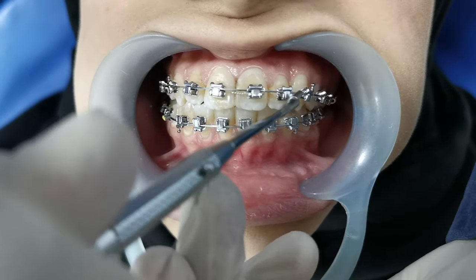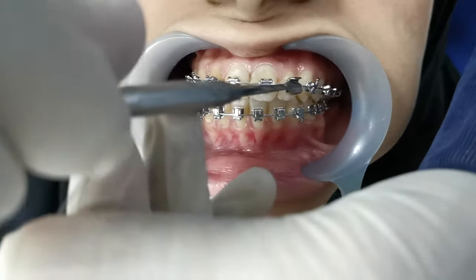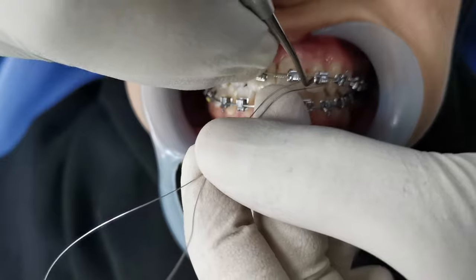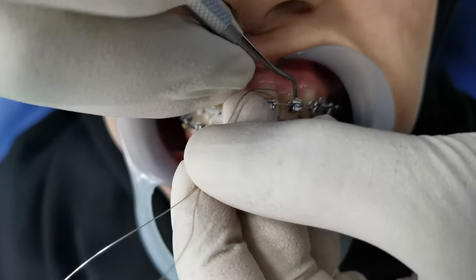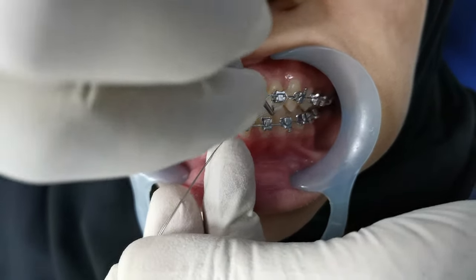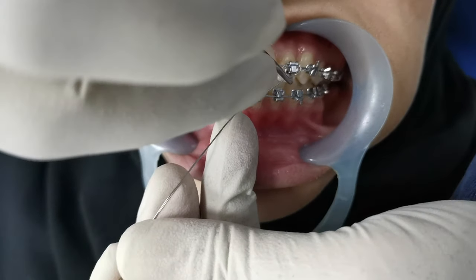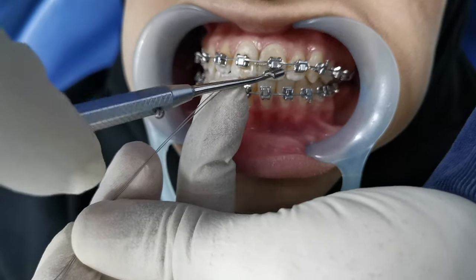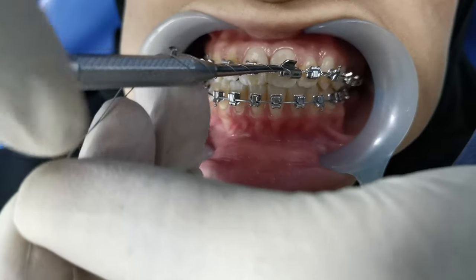In this process we can do from molar to molar based on your treatment plan. In this patient I am doing from canine to canine. At first on the canine, the ligation has been done until the lateral incisor inter-bracket span. After that, using the ligature wire director, I am adjusting on the lateral incisor. Now using the twister, I am twisting in the same fashion.